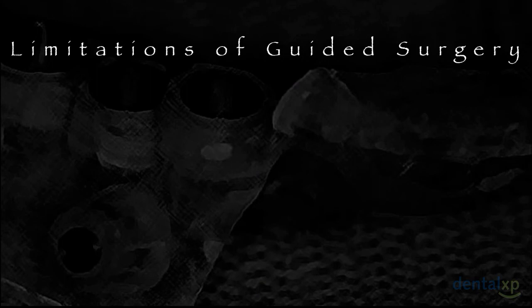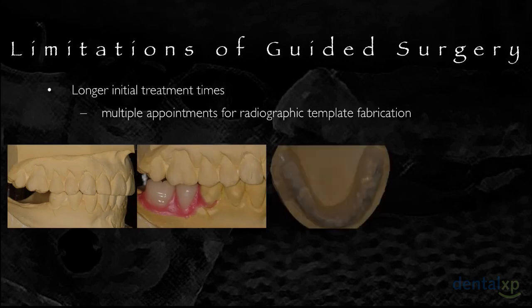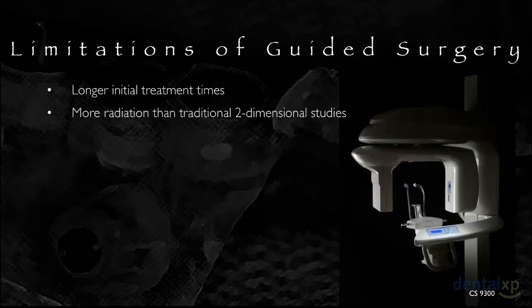But there are always limitations, and limitations to guided surgery. Some may say longer treatment times. Especially with this system, we have multiple appointments based upon the fabrication of a radiographic template even before cone beam data can be acquired. We need to make the impressions, create a diagnostic wax-up, then a radiographic template, plan it before we even have the surgical template.